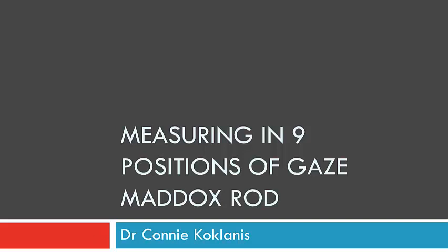Hi, my name is Connie and you're watching the video Measuring in 9 Positions of Gaze, Maddox Rod. In this video, we'll be discussing how to utilise the Maddox rod in measuring the deviation in the 9 positions of gaze.